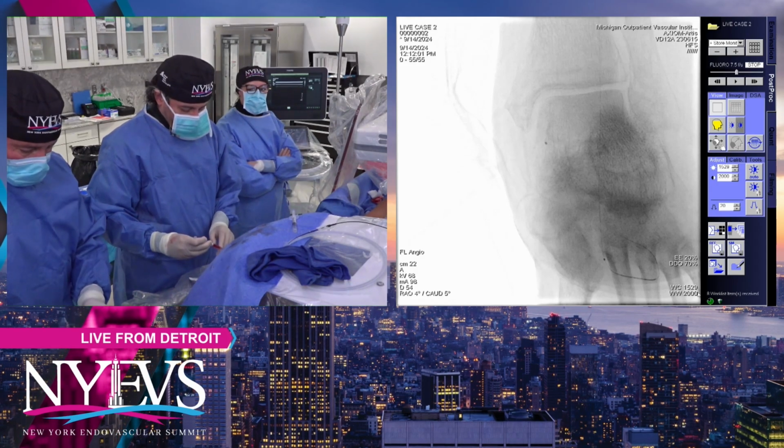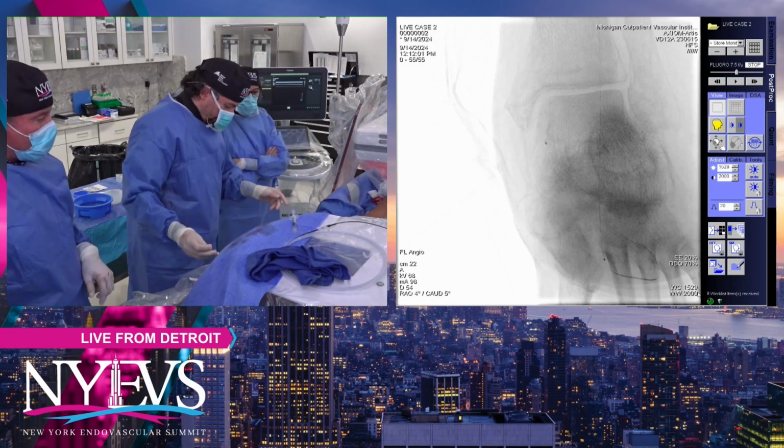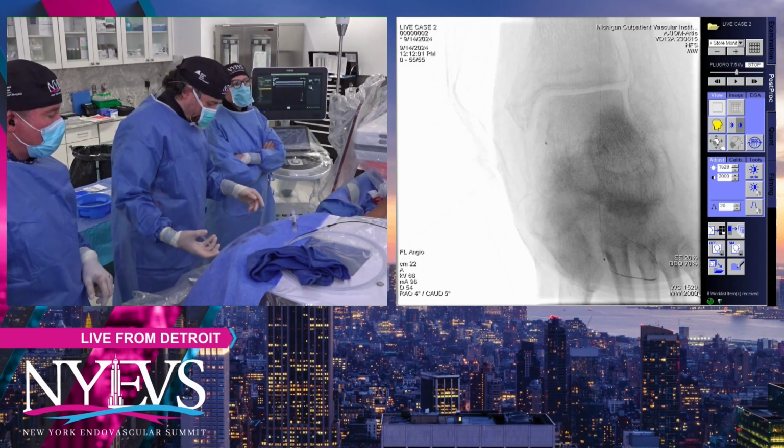Take a picture here. So I just removed my wire. I'm going to take a picture here just to see what we're dealing with.